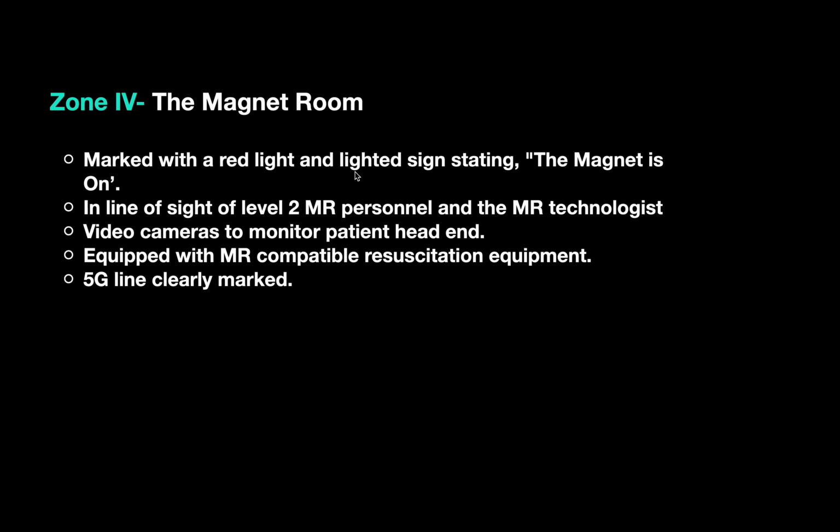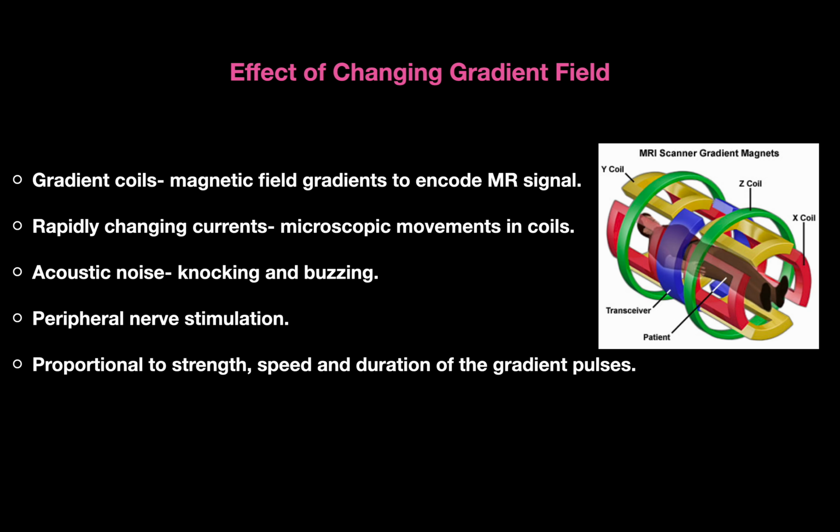MR level 1 and level 2 personnel are certified by the ABMRS. The room has video cameras to monitor the patient, is equipped with MR compatible resuscitation equipment, and is clearly demarcated with the 5 gauss line. Okay, so this is zone 4.